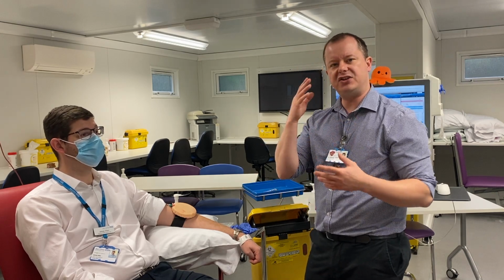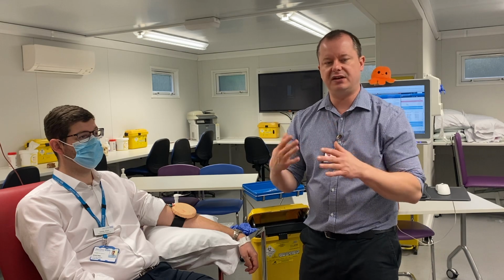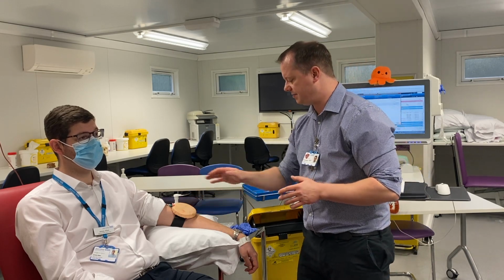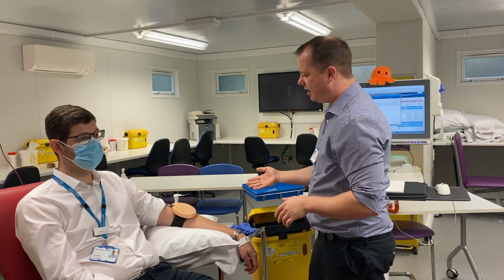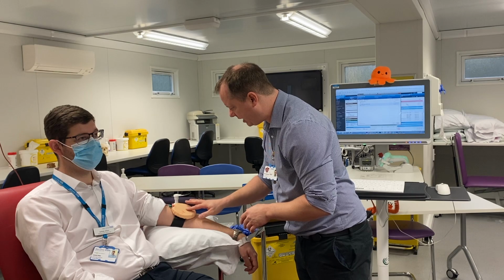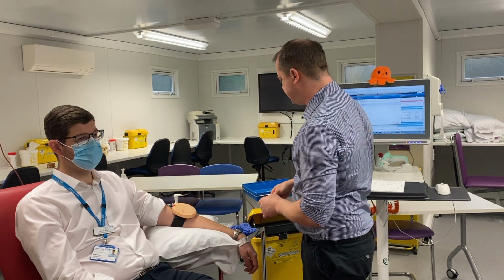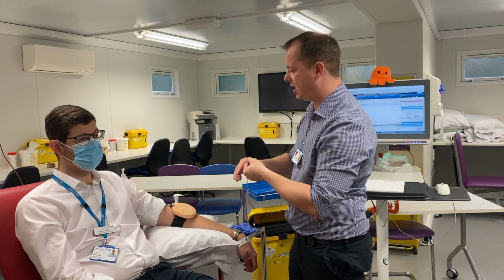No. I want to make sure that there aren't any reasons like fistulas or lymph node clearance or anything like that that's going to interfere with my blood sample, and also make sure there are no cannulas with any infusions running. I can then have a little look at my veins visually just to see if I can feel any veins, and I can see there's some good potential there, but I will put my tourniquet around the patient's arm to see what comes up.